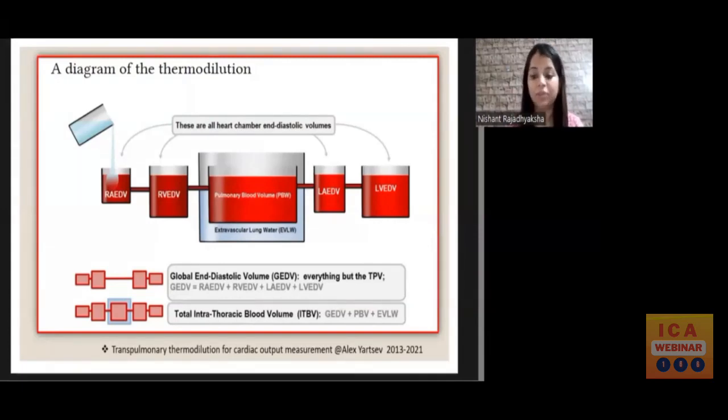And since we capture the pulmonary blood volume, we try to take out many more variables which a conventional Swan will not take out. The other fundamental difference is that Swan Ganz catheter basically functions on principles of pressure. On the other side, in transpulmonary technique, we have volumetric variables. There is an age-old debate in intensive care and cardiac ORs, which variable is better, pressure or volume.